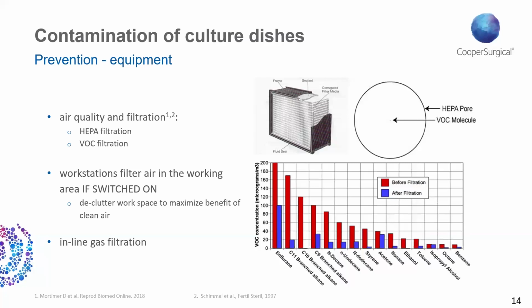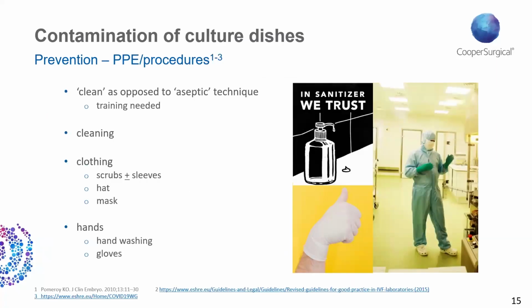And in all cases, including your equilibration incubators, inline filters are critical to keeping VOC levels to an absolute minimum and minimizing the impact that they may have over time on your culture system. So we then need to think about ourselves in the lab and the use of PPE. This became acutely in focus during COVID, and we changed many of our protocols. But as you can see on the slide, we can only really aspire to clean technique. We'll never work with aseptic technique because the embryology lab doesn't allow us to do that.